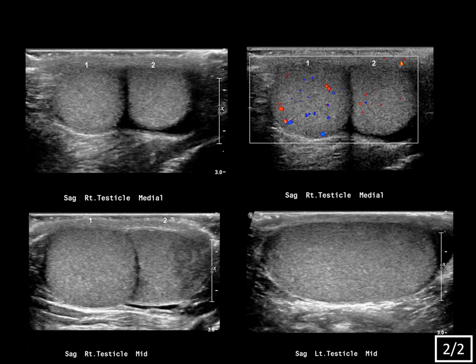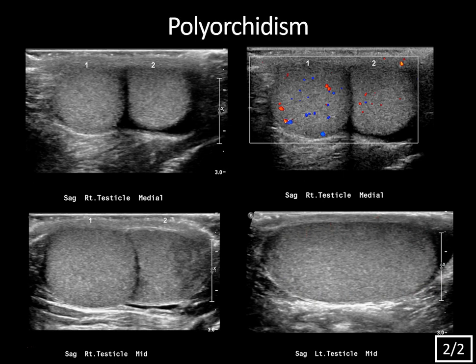Looking at the static images, the upper image shows the two testicles in the right hemiscrotum, nicely labeled by the technologist. There's also color Doppler flow in both of the testes, slightly less in that second testis, but still flow. The lower images show another sagittal image of that dual testicle in the right hemiscrotum compared to the single normal testicle on the left side. This is polyorchidism — a supernumerary testis — referring to the presence of more than two testes. It's not too common, but this is the most common type with three testes. It's usually more common on the left. One of the main complications is testicular torsion, and there's also an increased risk of malignancy.